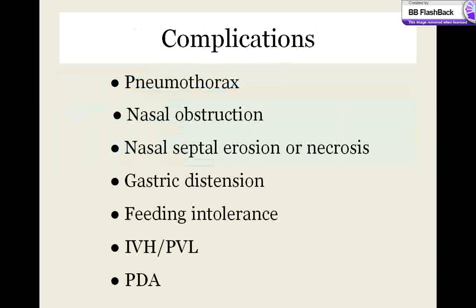The goal of monitoring is to judge the adequacy of CPAP and look for preventing complications of CPAP. Complications are mainly nasal obstruction, nasal septal injury, erosions, pneumothorax, and CPAP belly.